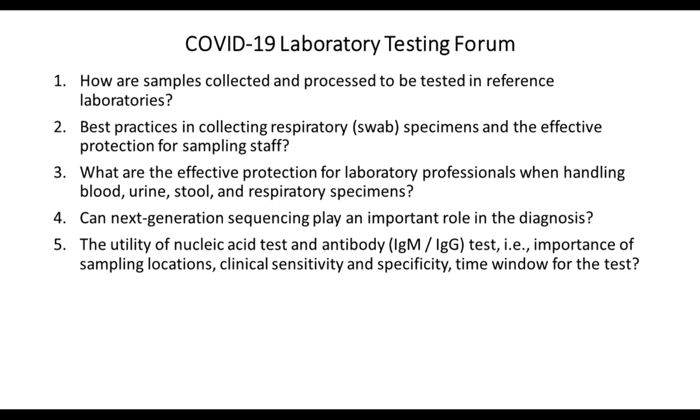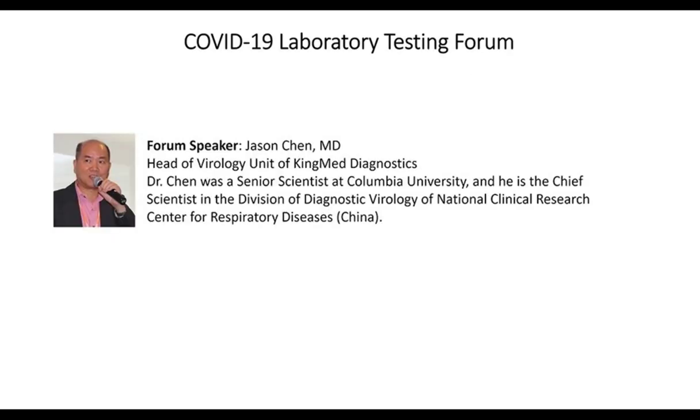What we emphasize for the importance of the collected specimen is to keep the swab against the tissue for about 10 seconds and turn it around a couple of times before you take it out, so that you can get more cells, because the virus is inside cells. That's important. And for the swab itself, we use synthetic fiber swabs with a little brush at the tip.